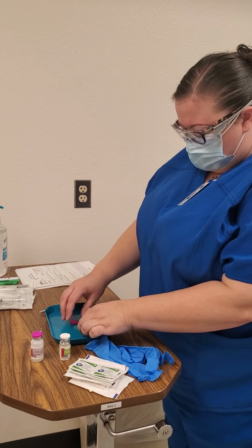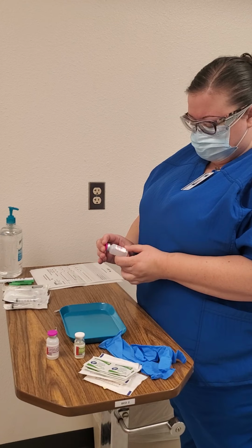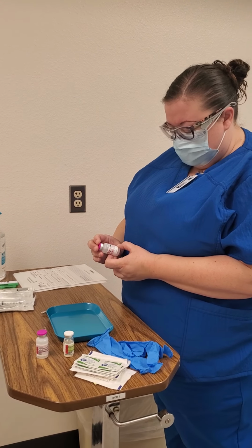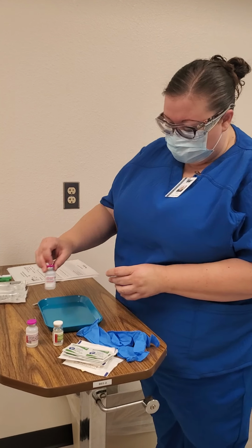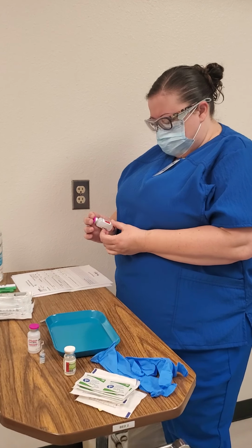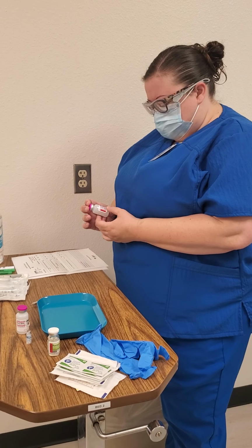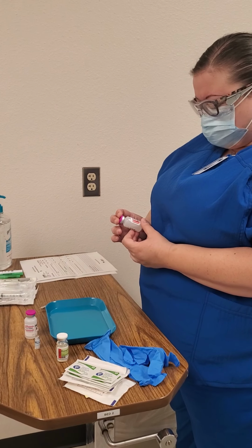My first thing that I'm going to do is check my saline solution for an expiration date, and that's 7/2024. Here's the tuberculin purified protein derivative, and it says a 10 milliliter multi-use vial.